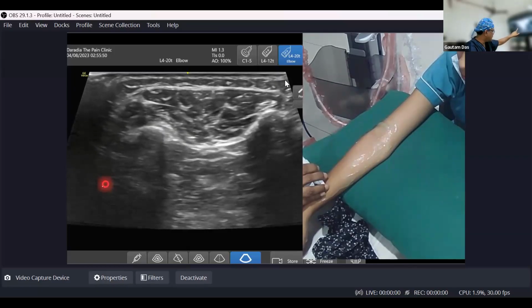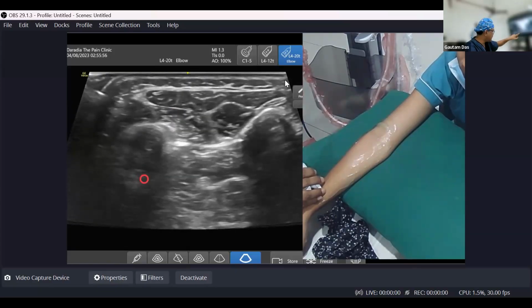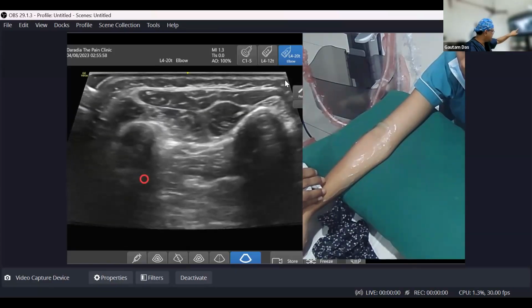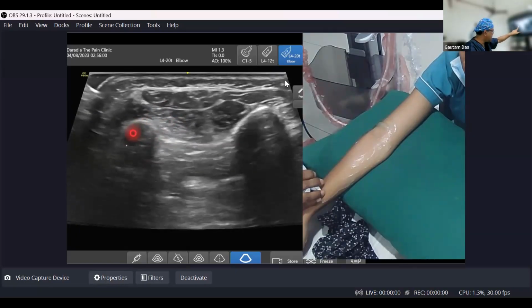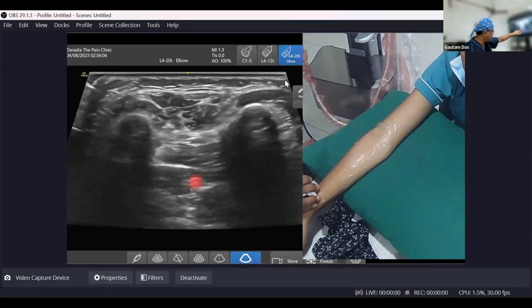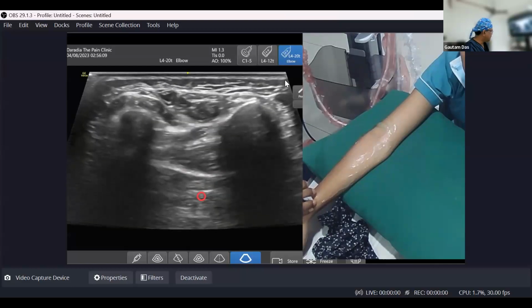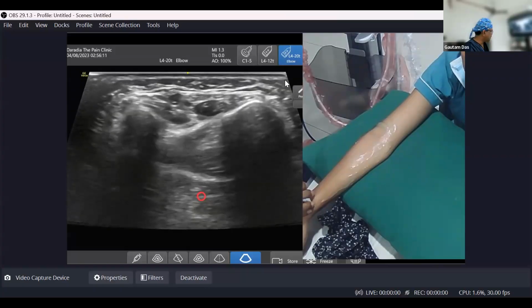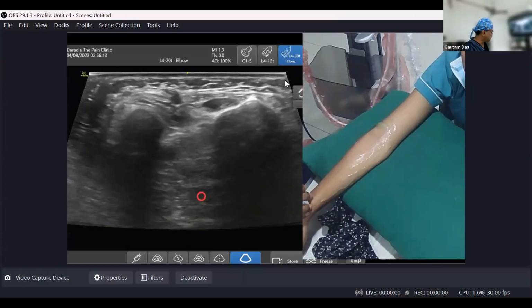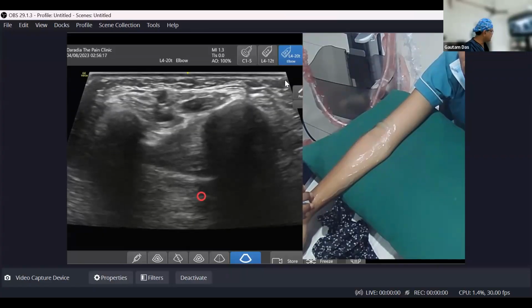Okay. So here is the nerve and artery. Just see the pulsations there. Now coming down deep. Now it is coming below the extensor indicis. So see here, this one coming down here. Below the extensor indicis, as I told you, the last branch of the posterior interosseous nerve is to your extensor indicis muscle. You can see the nice pulses in there.